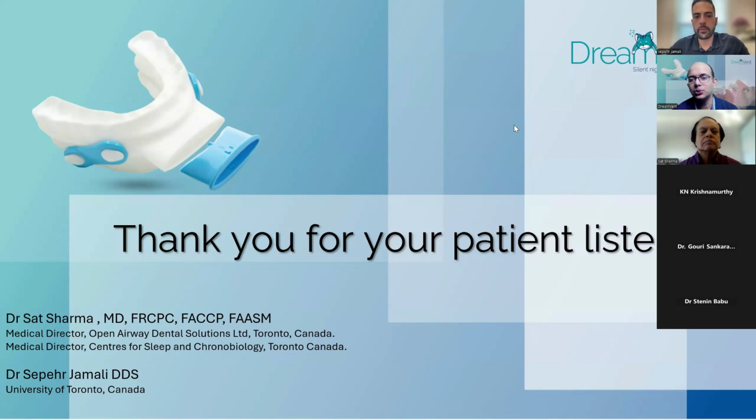So we have another question. Will it help in patients having nasal congestion or having DNS? Yeah, for sure. Yes. That's exactly that. Then we see the best results in those patients. They see the subjective improvement of their sleep a lot better because they are always clogged. So giving them almost a second nose with the appliance definitely helps them a lot.